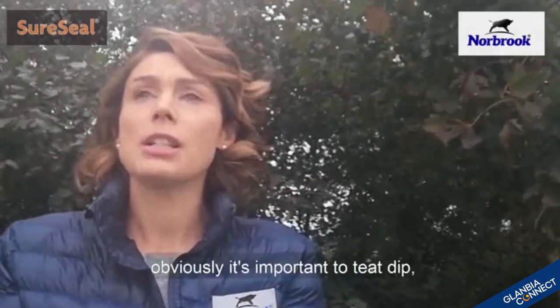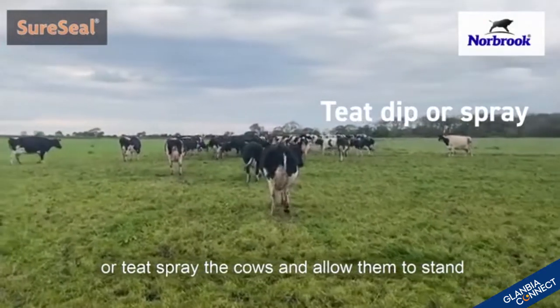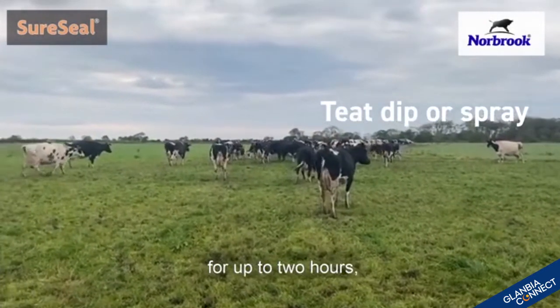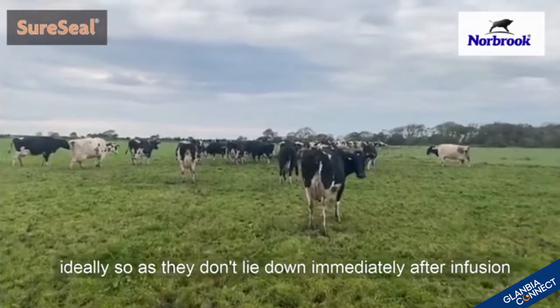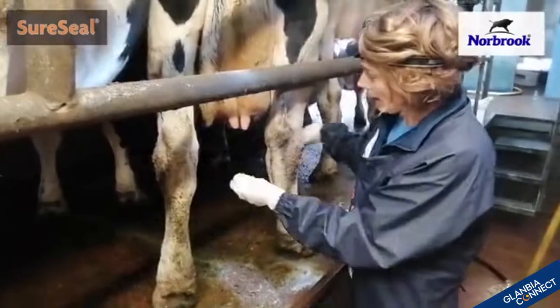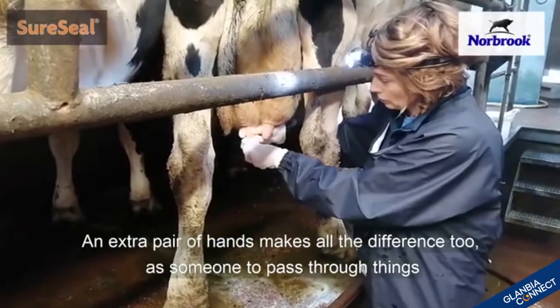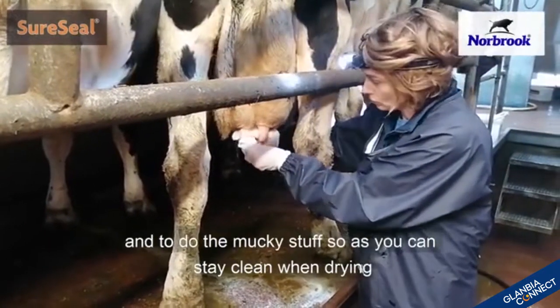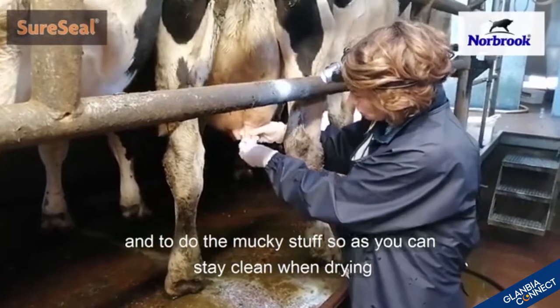After treatment, it's important to teat dip or teat spray the cows and allow them to stand for up to two hours ideally, so that they don't lie down immediately after infusion of dry cow. An extra pair of hands makes all the difference too, as someone to pass things through and to do the mucky stuff so that you can stay clean when drying off cows.